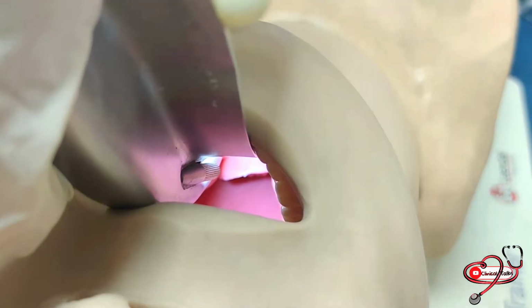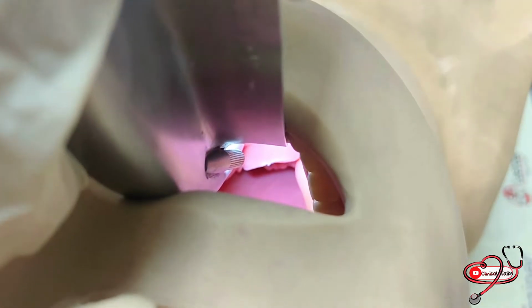Okay, now you can see the epiglottis. Lift up the epiglottis by pressing at the back of the epiglottis. See, now you can see the vocal cord very clearly. Now we can introduce the endotracheal tube.